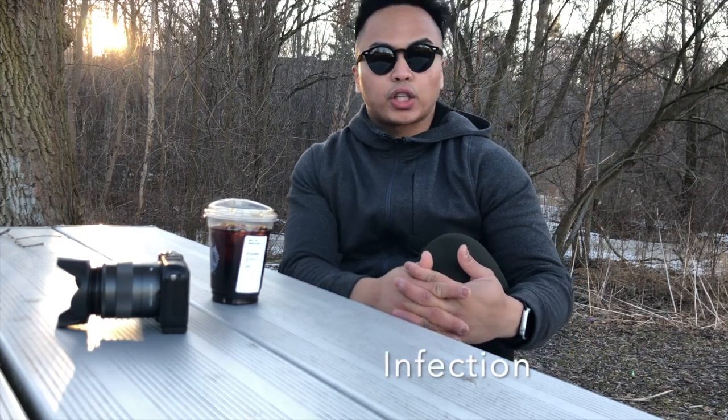Now, let's discuss some possible complications that may occur after image-guided joint injection procedures. Some patients may experience allergic reactions since we are introducing contrast media or medications into the joint space. Since we are aspirating the joint space, we also need to advise our patients to keep track of any signs and symptoms of infection at the site. Some things to watch for include redness at the site or possible swelling at the joint space.